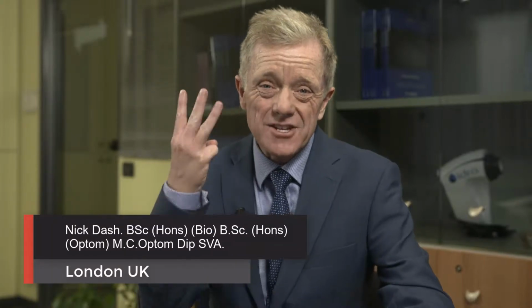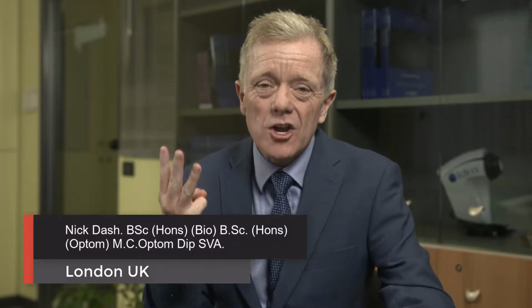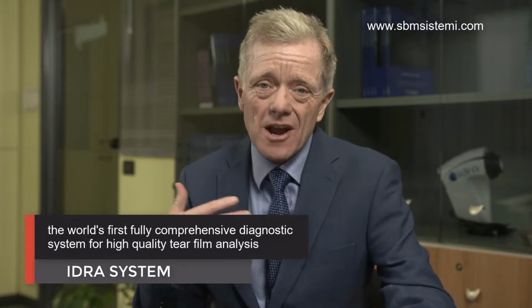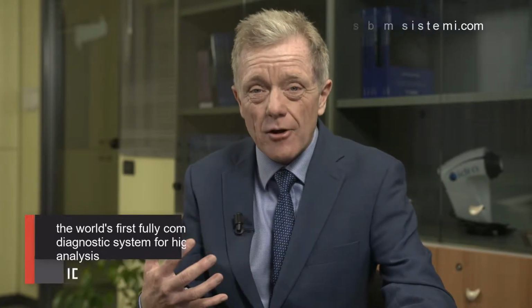Colleagues and friends, give me just 3 minutes to talk to you about ocular surface and dry eye, and it will change your clinical practice, as it has done my clinical practice. So think of the ocular surface as that very first layer, refractive layer of the eye. It's not the cornea, it's the tear layer. So that ocular surface is critical to all the refractive procedures we might do within a clinical practice.